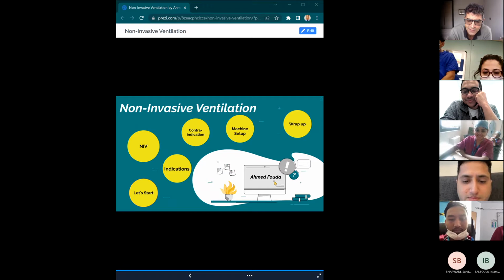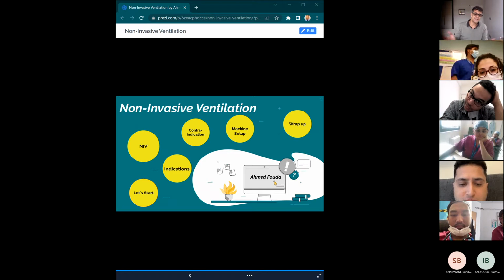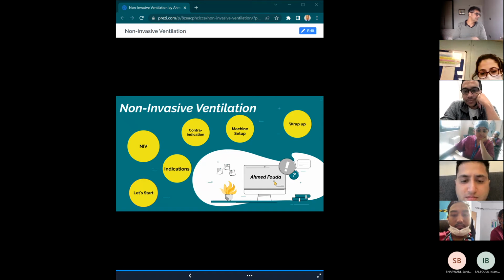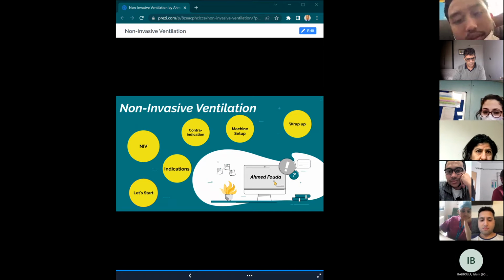Yeah, so tell me about the other physiological changes. It's the same as being on a ventilator. So essentially, it's just that it's less secure. We're just applying it here rather than through a tube. Sometimes the breathing doesn't synchronize, the patient is not breathing with the machine, so sometimes that could also put pressure on the respiratory muscles.